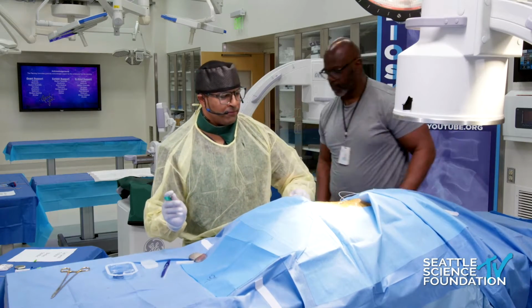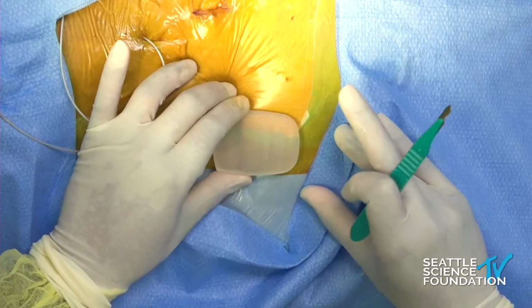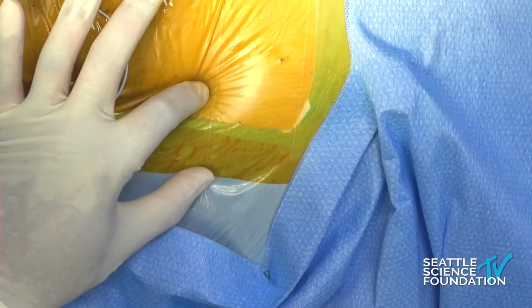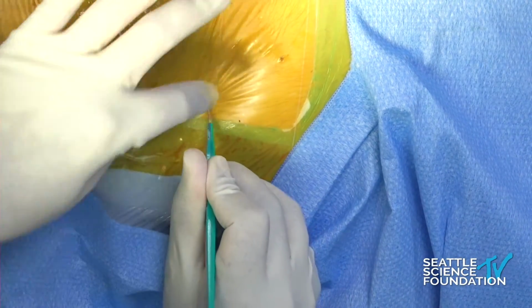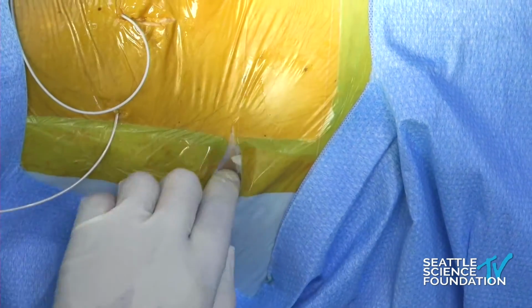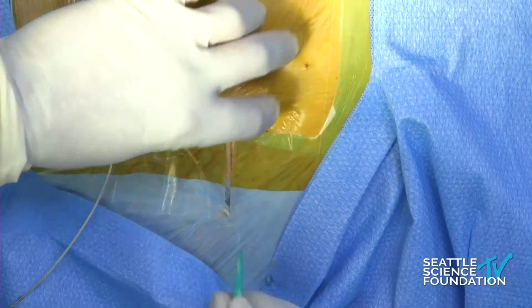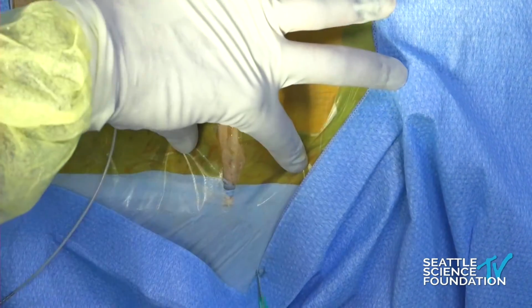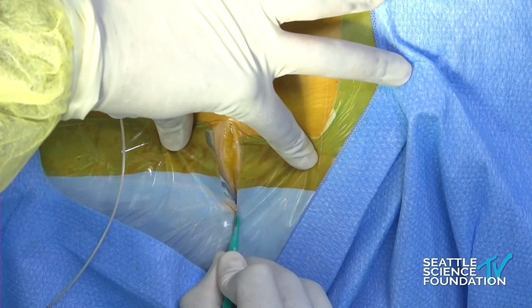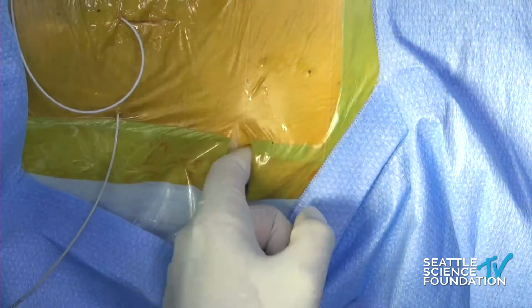No, it's all good. So if we have this template right here, it's about 4 centimeters across. Again, we'd have this all marked out, but I just wanted to demonstrate tunneling just so you have an idea of how to do that safely. A lot of people look at the tunneling instrument and go, wow, that's really dangerous, it's sharp or whatever else. Perfect. Not the sharpest blade that we have, but that's okay.